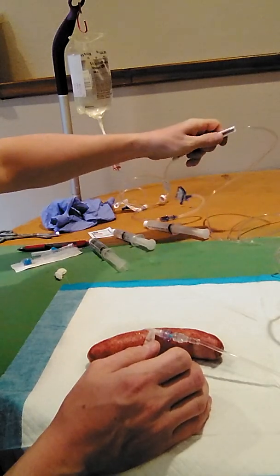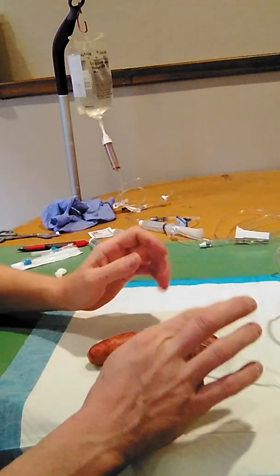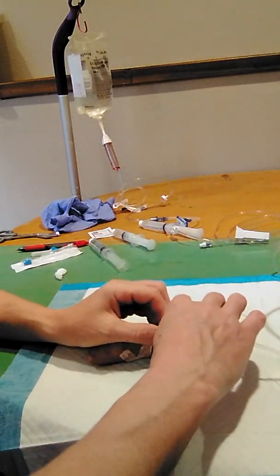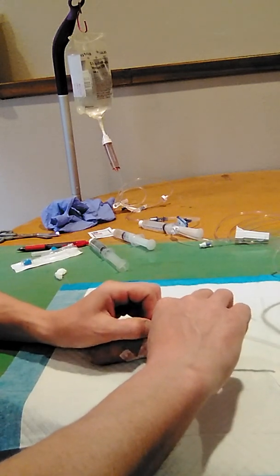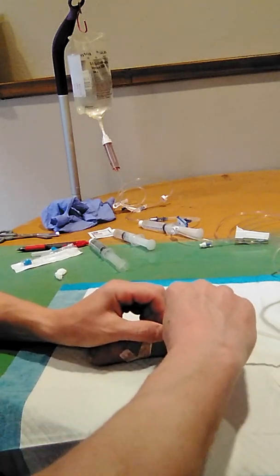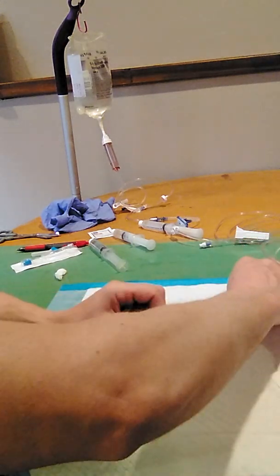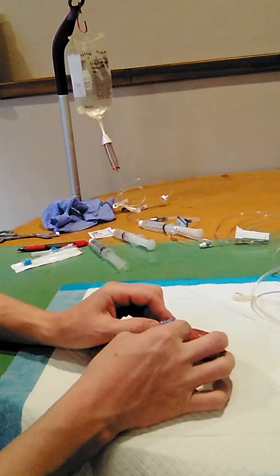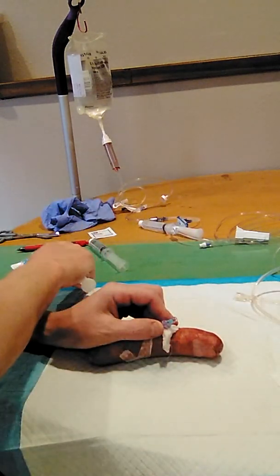So firstly, I'm going to lock this IV. So I'm going to stop its progression. And I'm going to expose the catheter hub here and loosen any tape that I need to. So I'm going to place some gauze between the patient and the IV hub.